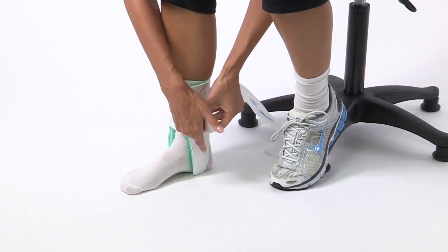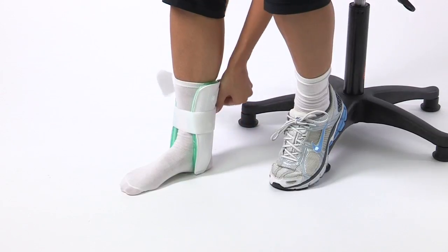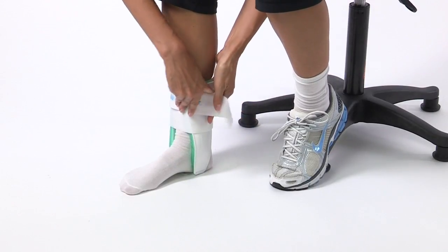If you sprained your ankle or have chronic ankle instability, the Aircast Air Stirrup can help. The Aircast Air Stirrup is the number one prescribed ankle brace in the world, and its superior performance has been documented in over 100 medical journals.